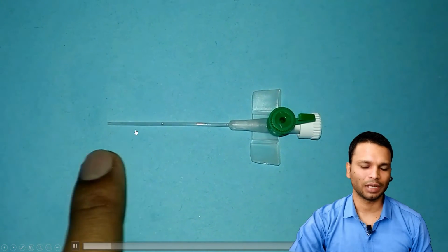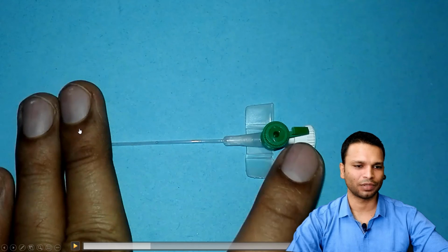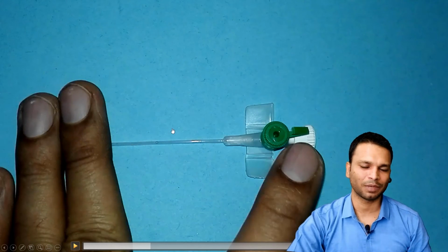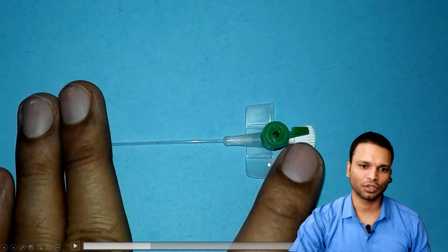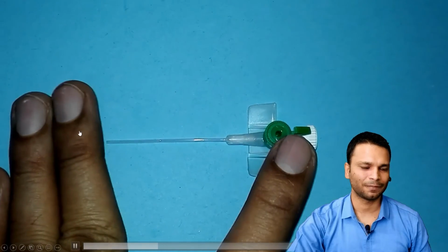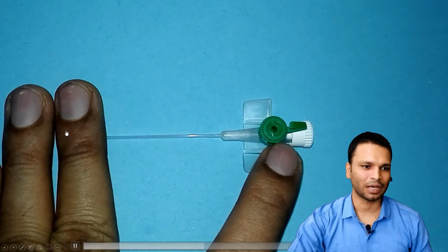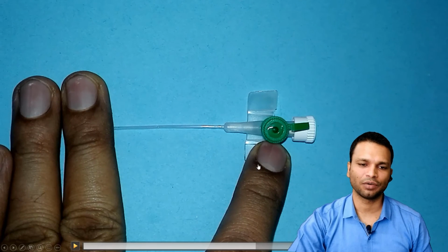So you can see the full length of the cannula. What I have done is I have placed the fingers at the end of where the cannula length ends. I kept two fingers over there. This is what I prefer. I don't place my fingers on the cannula, I place my fingers at the end of the cannula. And in the previous video, the doctor placed his fingers at the wing region. Now you can see the two fingers placed at the end of the cannula, applying pressure over the vein, and the doctor in the previous video, his index finger was placed over the wing to keep it in proper position.